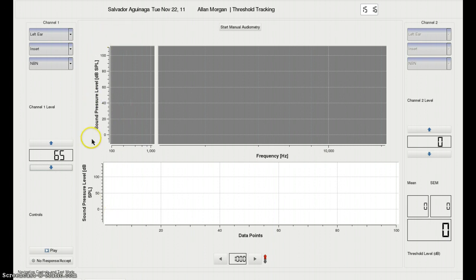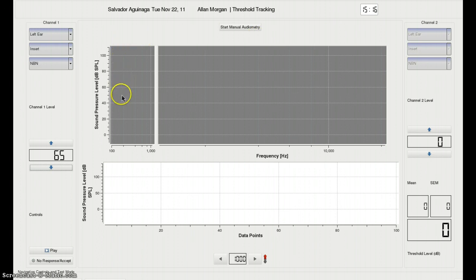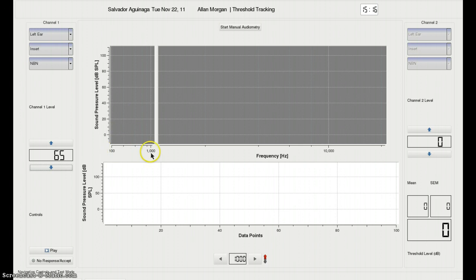Also, there are a couple of plots here. Instead of one plot, which will show the thresholds, they're now to ANSI standards. This will go from 100 to 1000 Hz, and this one goes up to about 20k.